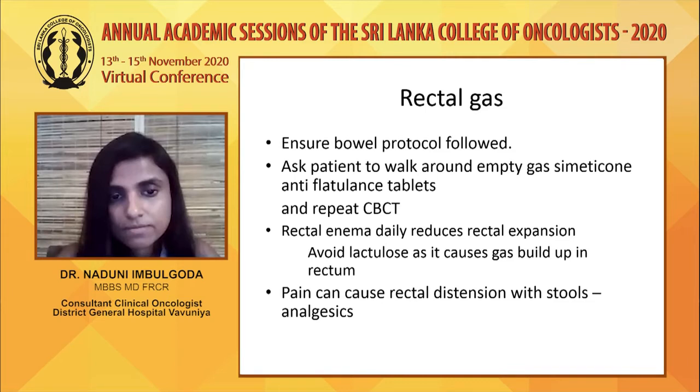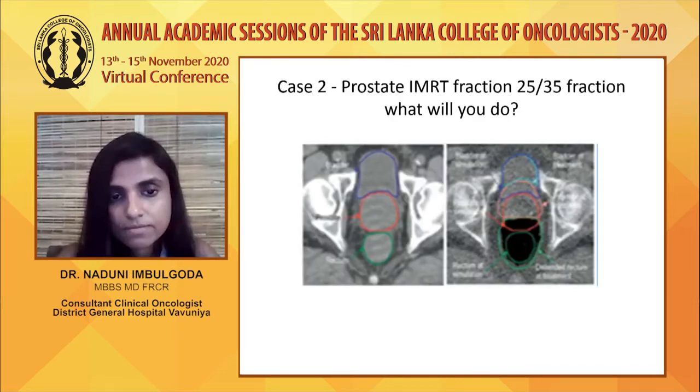So this is my second case. Just have a look at this plan. This is the first plan on the 25th fraction, same patient. What has happened here? And what will you do?